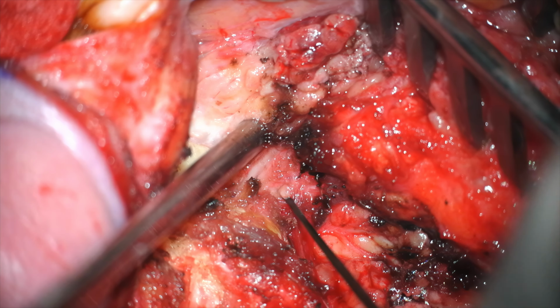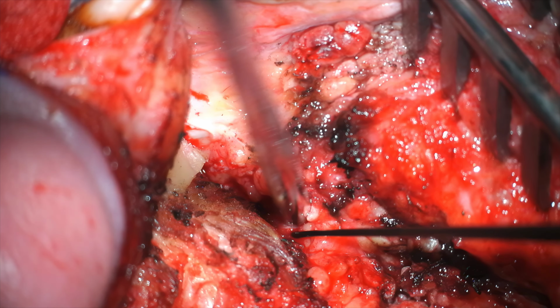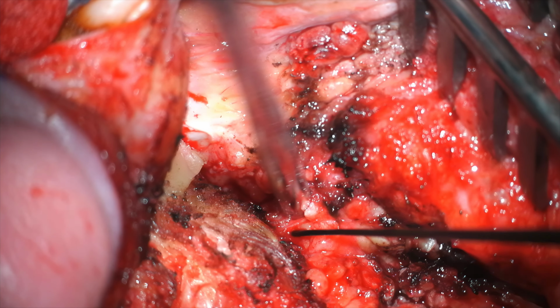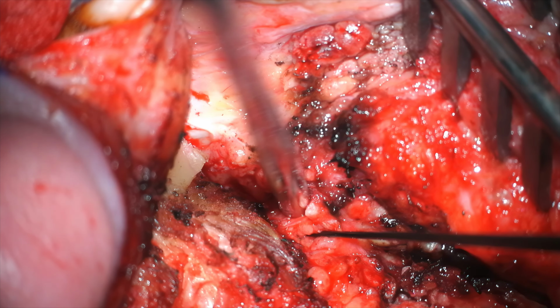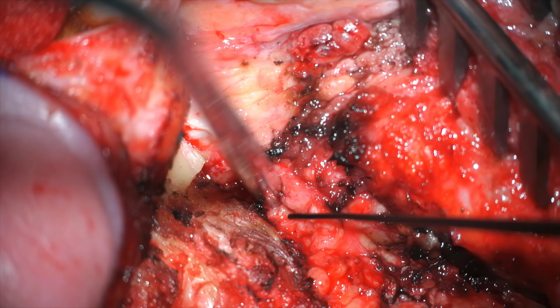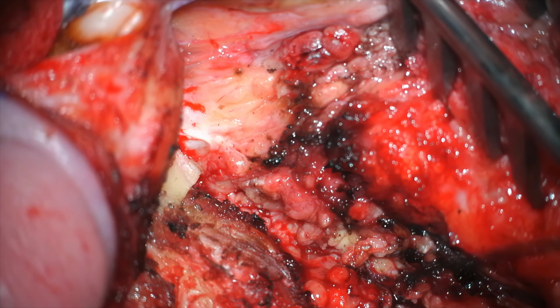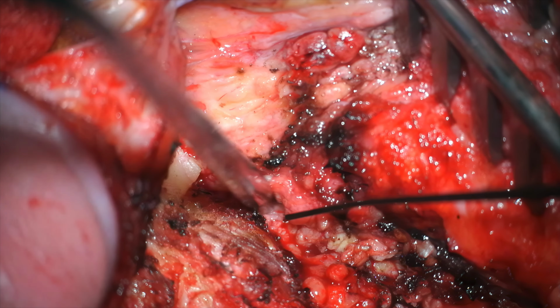Put the stim down to 1. Down to 1. 1.1, good enough. No, 0.9, good enough, good. Now stimulate in that area where you said to yourself, oh, is that a nerve? Right in there, yeah, go ahead. Okay. Nothing, right? Good. And you see that little bit of tissue right above your stimulator? Now you're going to bipolar, you're going to cut this band. Now, do that again. Now we're stimulating the nerve right where we thought we saw it. Right there. Good. Stop now.